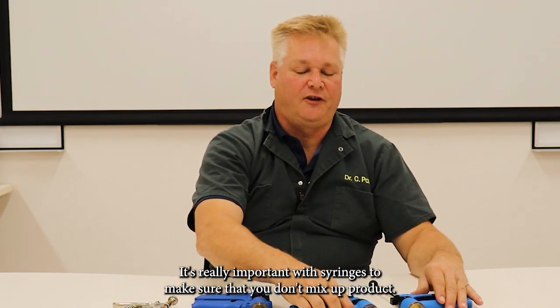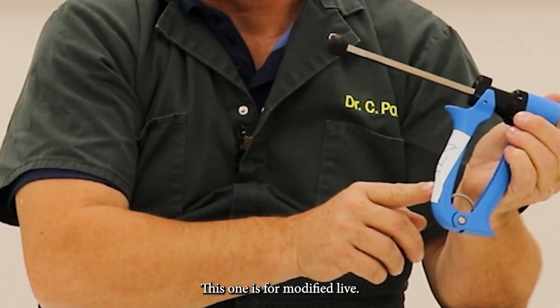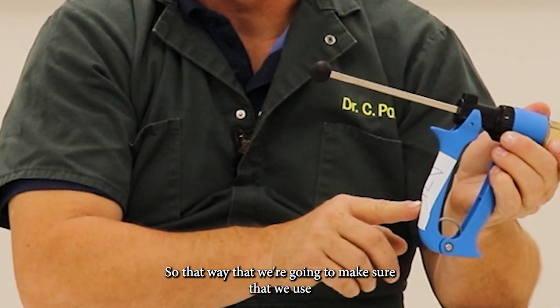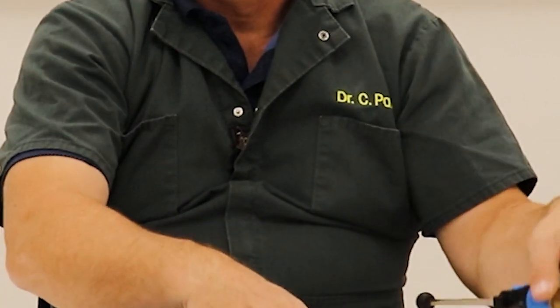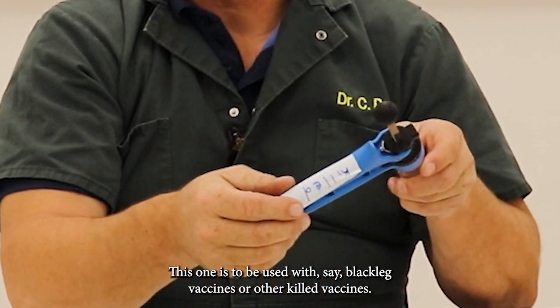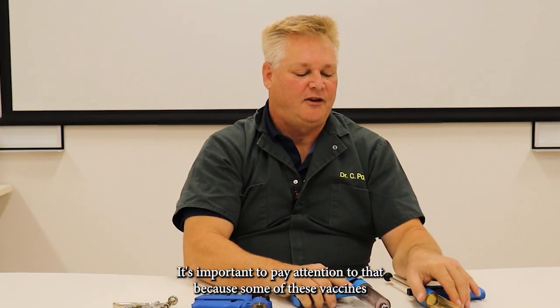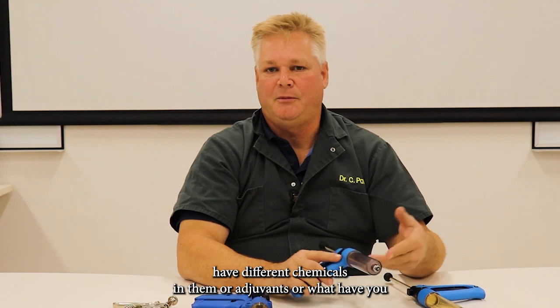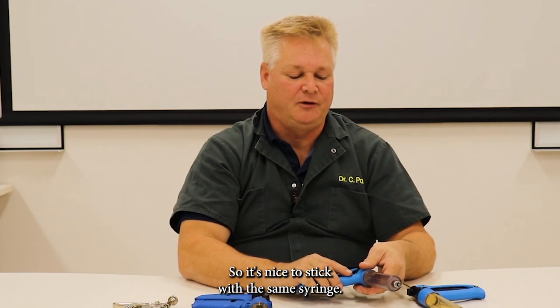It's really important with syringes to make sure that you don't mix up product. These two syringes are labeled — this one is for modified live, so we're going to make sure that we use all of our modified live vaccines with this particular syringe. This one here is marked killed, to be used with blackleg vaccines or other killed vaccines. It's important to pay attention to that because some of these vaccines have different chemicals or adjuvants that might render the other one inactive, so it's nice to stick with the same syringe.